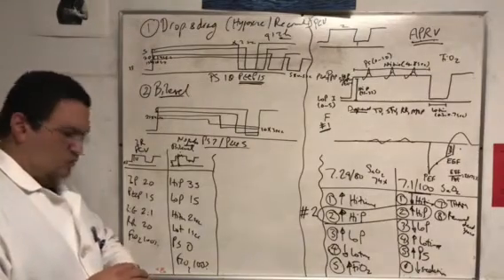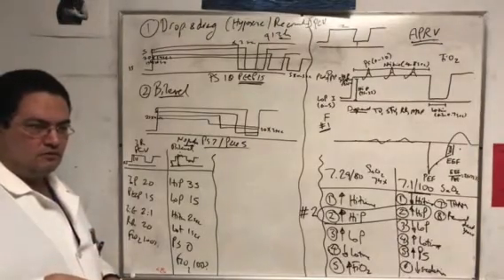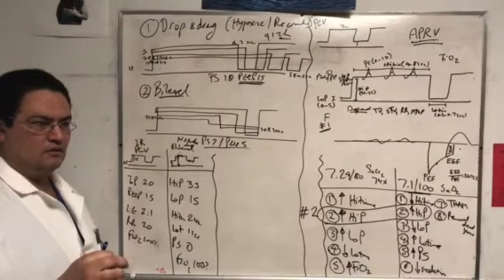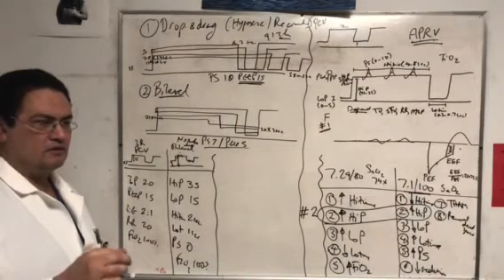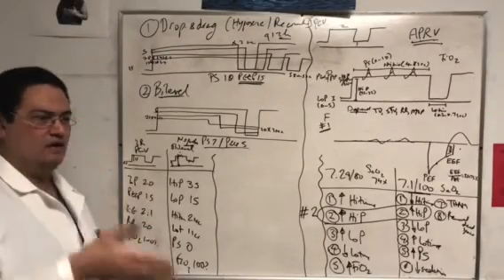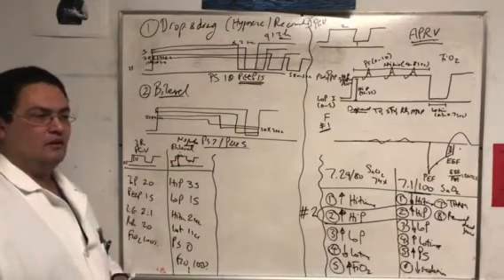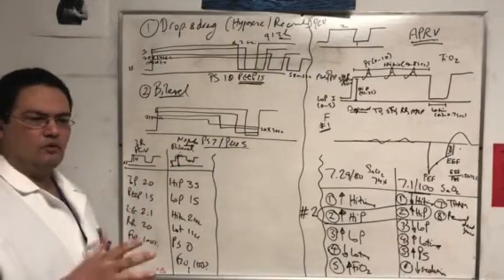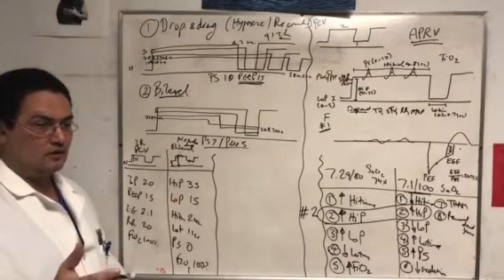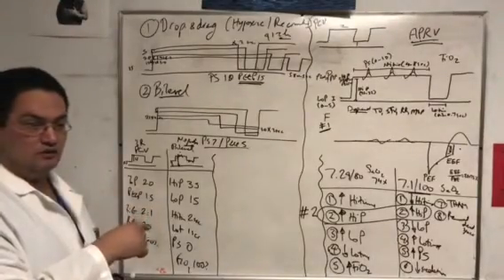So, the question now, why did we switch? So we switched this about, I think, 4 years ago. Actually, sorry, 5 years ago on the dot now. 5 years ago, we switched that everybody that comes to this ICU be on bilevel, not APRV, bilevel. And so where did that come from? Just because we want to switch, or because it's a big decision? It's not like we eliminated the other modes of ventilation. This is the only mode of ventilation in the ICU.